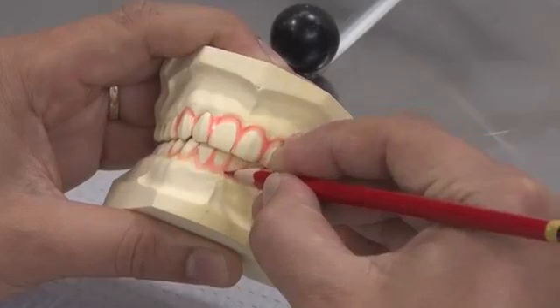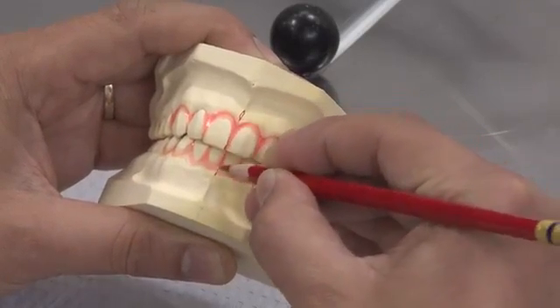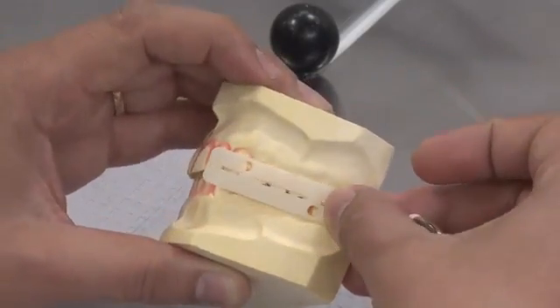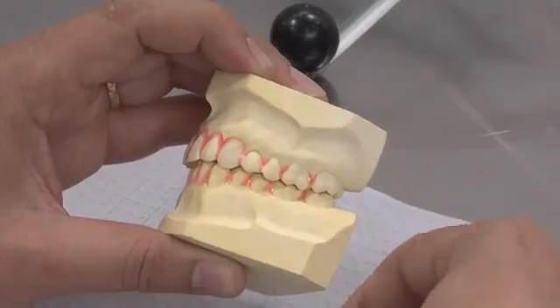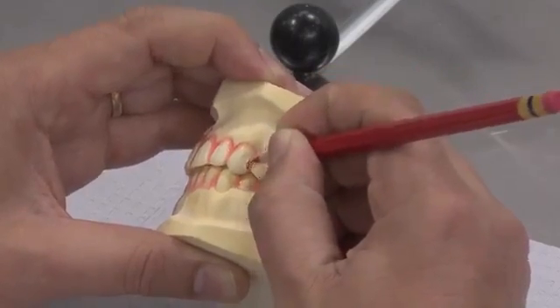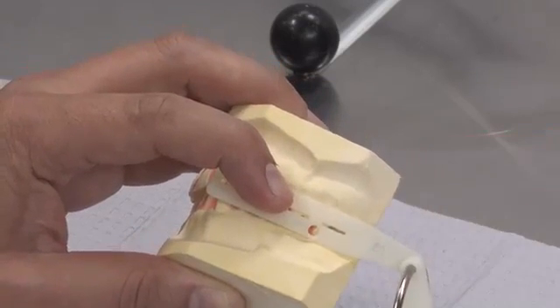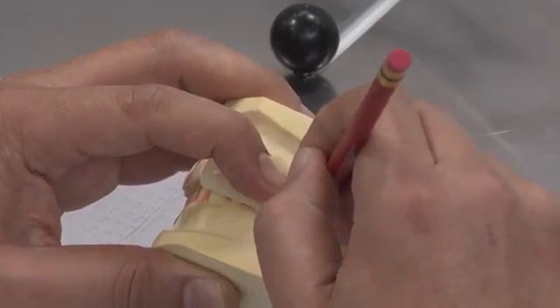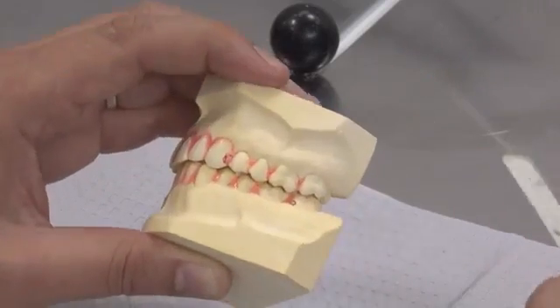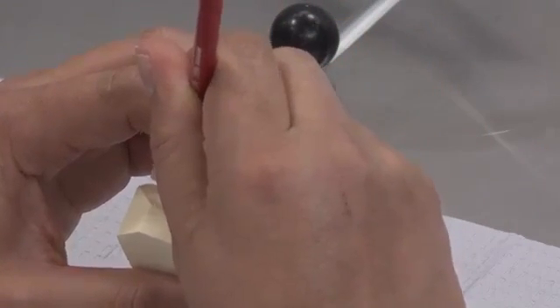Next, mark the midline on the upper and lower models. Place the 25mm EMA template on the model. Mark the upper model on the interproximal area between the cuspid and the first bicuspid. Line the template up again and mark the lower model. Do the same for the opposite side of the arches.